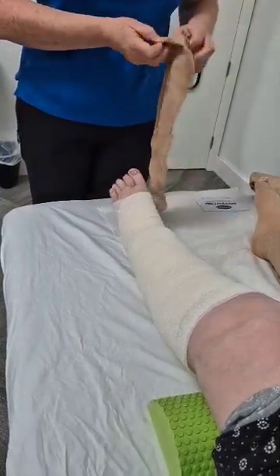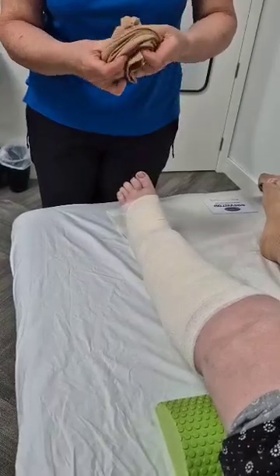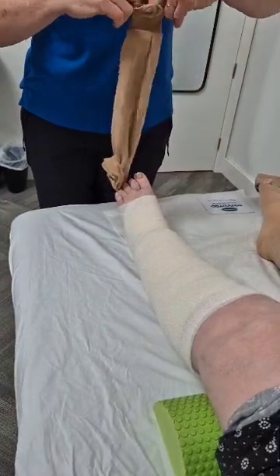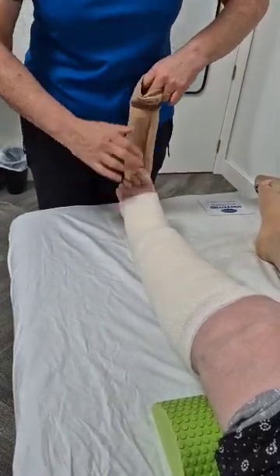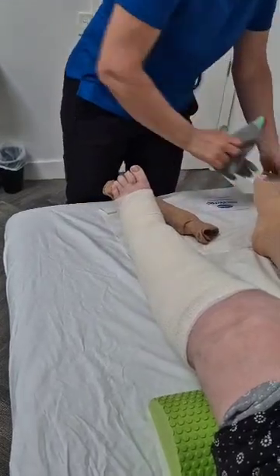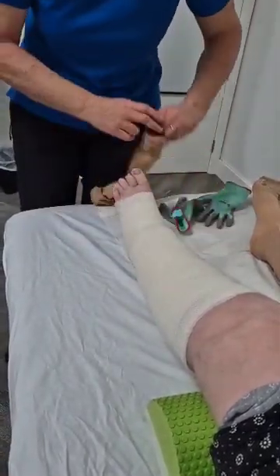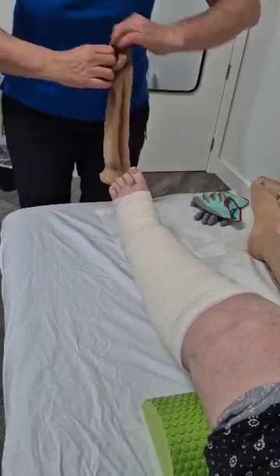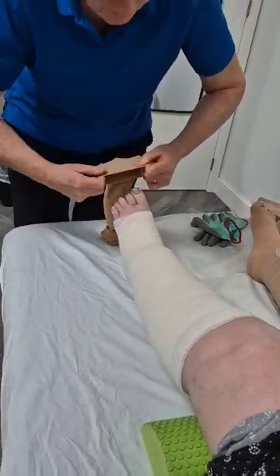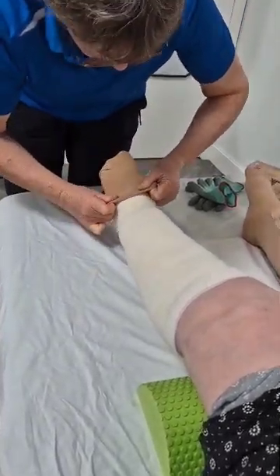So what we will do is you take your garment and you turn it down so that you are down to just the heel. And then we are going to put this over the top of the crepe bandage, and you can imagine it can be hard because we don't want to cause wrinkling here. So what I do when I'm putting these on is I open them up, I stretch them nice and wide with my hands, and then we put them onto the foot.